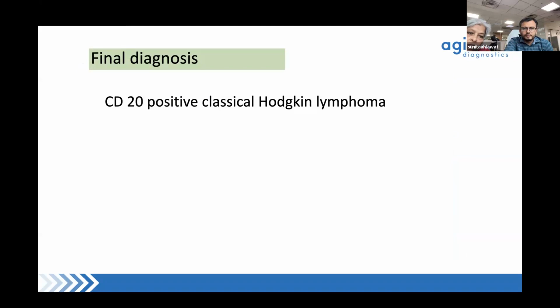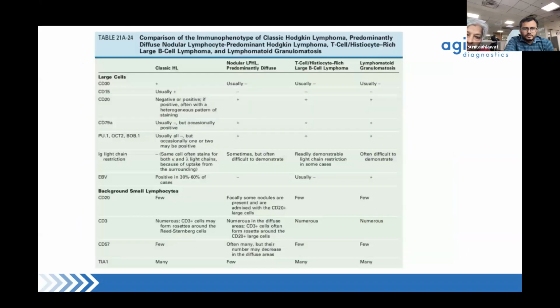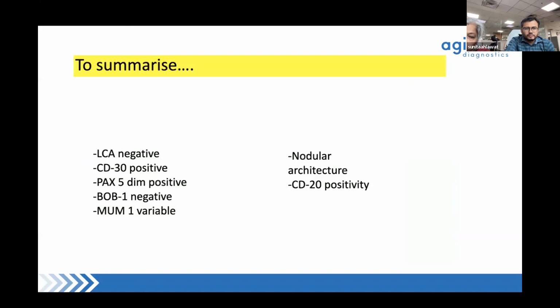You know, this patient, when he came to us, came with different diagnoses from eminent pathologists all over India. And then to our surprise, I felt it was looking like a Hodgkin lymphoma on morphology, but then it came out to be very strongly CD20 positive.